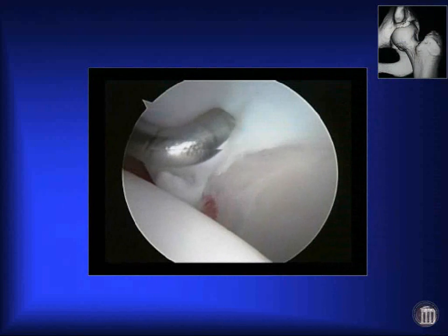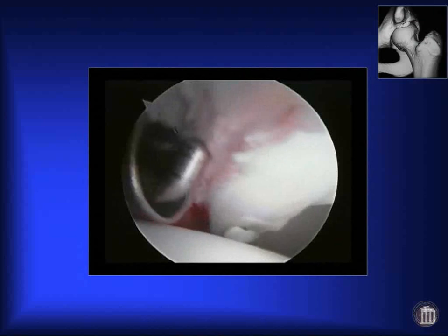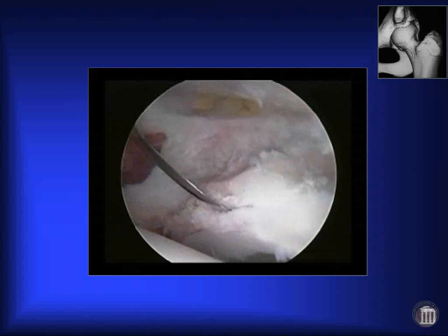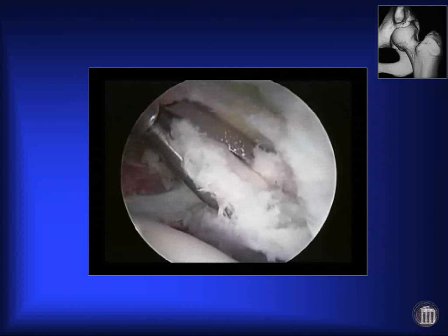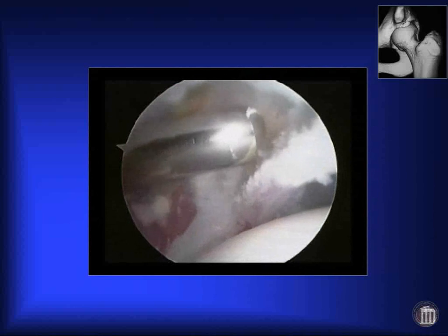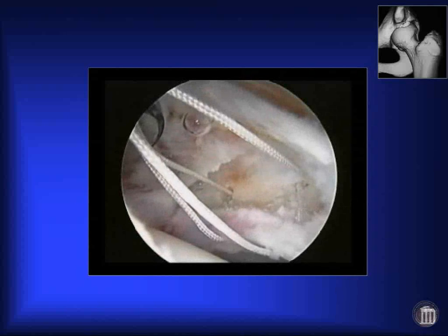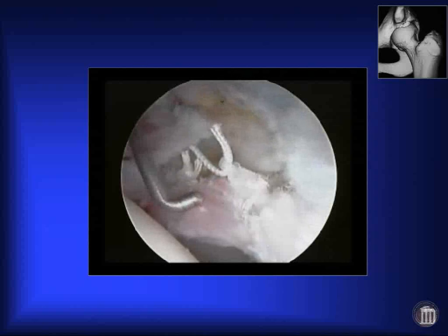We go in arthroscopically, you can see the articular failure, the labrum is failing. It hadn't completely fragmented, but this is a young girl and you don't want to wait until the labrum is destroyed. We're mobilizing the labrum, we'll remove the separate bone fragment. Then we'll recontour the acetabulum, correcting the pincer lesion. We've placed our anchors, placed the sutures. We've refixed and preserved the labrum in this case, and then we'll go to the periphery.